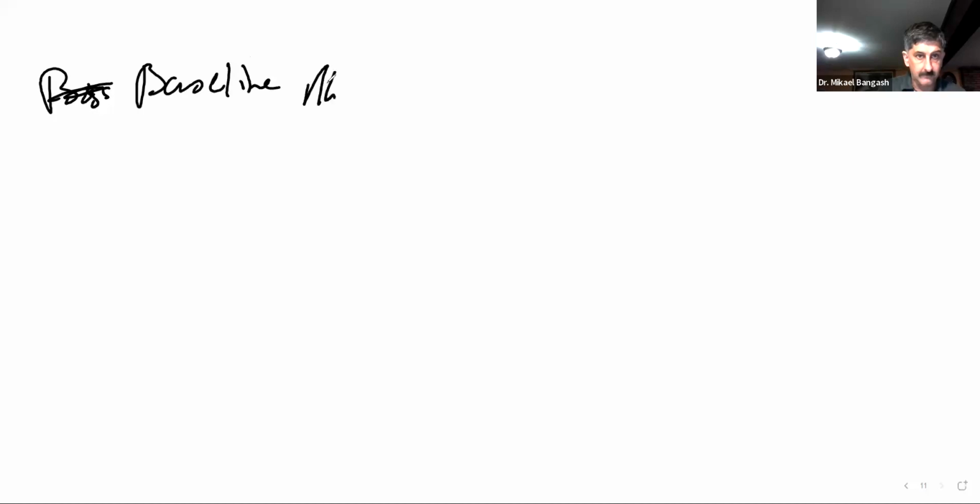Now the next step that you can do to get rid of aliasing is what we can call a baseline shift.